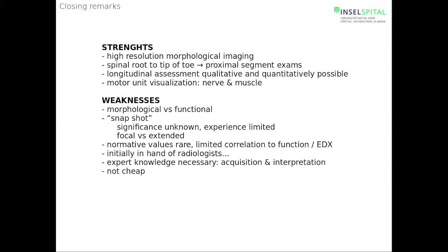Initially, it was only in the hands of radiologists, but now more neurologists and neuroradiologists see the potential and start to work together to tailor such protocols. And of course, the weakness is that there's quite some expert knowledge necessary regarding the acquisition, especially in the interpretation.